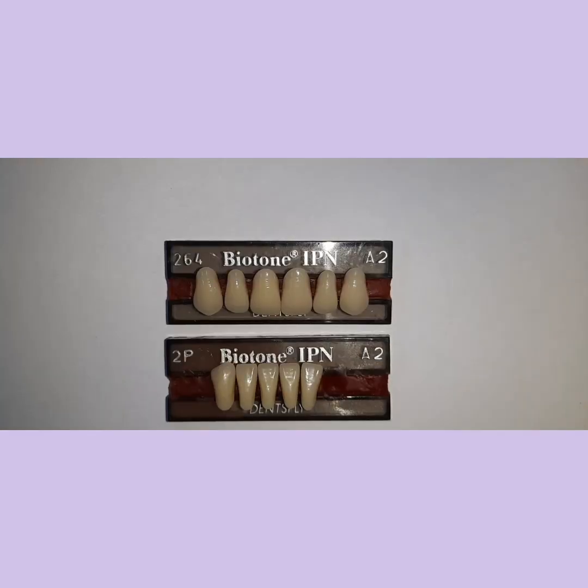On the other hand, when we talk about acrylic resin teeth, in comparison to porcelain teeth they are less aesthetic and less resistant to wear. Although recently you have cross-linked teeth which have considerably greater resistance to wear. One very big advantage of acrylic teeth is that they chemically adhere to the denture base. They have a softer impact sound in comparison to porcelain teeth, which have more of a brittle, clicking sound when they come in contact with each other. And acrylic teeth tend to stain more rapidly than porcelain teeth.